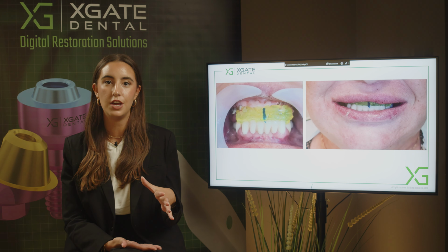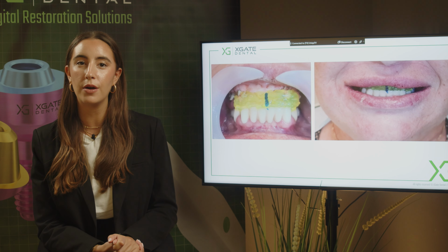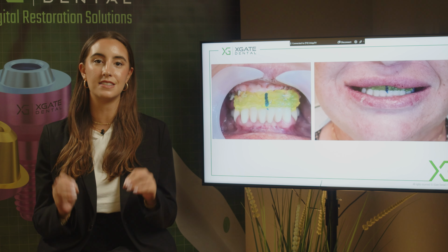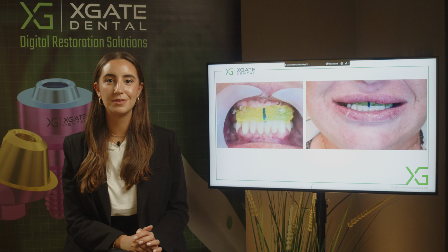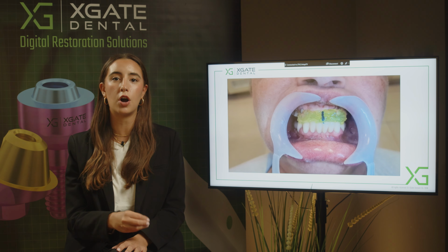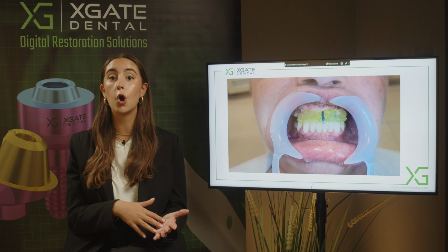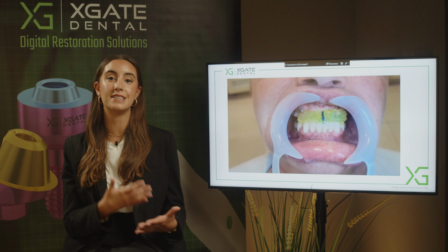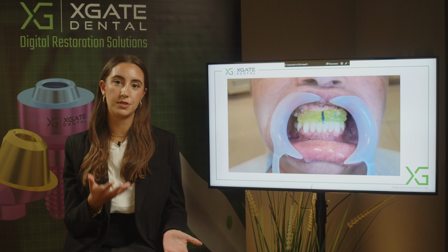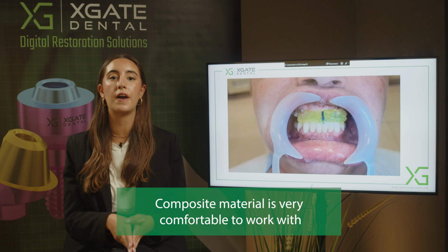You can see in this VDO that when the patient opens and closes her mouth, the teeth go back to exactly the same place. First of all, the composite material is a hard material. It's not like wax. So if she closes a little bit stronger on her teeth, she won't deform the composite. And on the other hand, she can open and close and get back to the same spot exactly as we built the composite material. So with this composite material, we know the exact VDO that we chose.